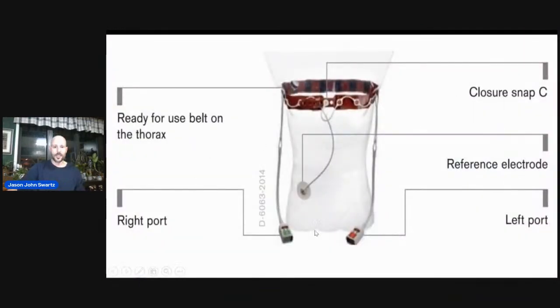these two dangly things over here, I usually put them under the armpit because that's where they'll end up being. So then it's slid behind the neck, it's under the armpit, and then all I have to do is advance it, lower it. There's a little notch to put it on the spine, and you just want to make sure that when you close it, 1 and 16 are on equal sides of the sternum, okay? Or else you're going to have a curved image.